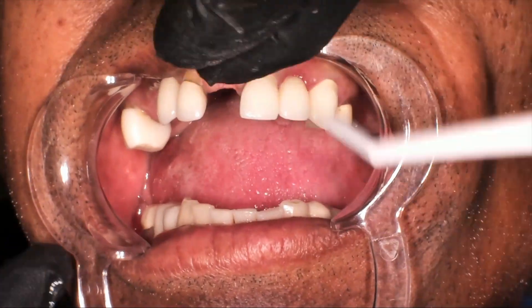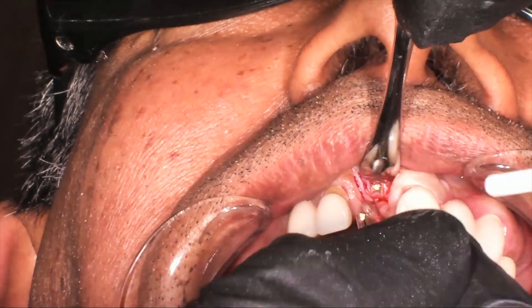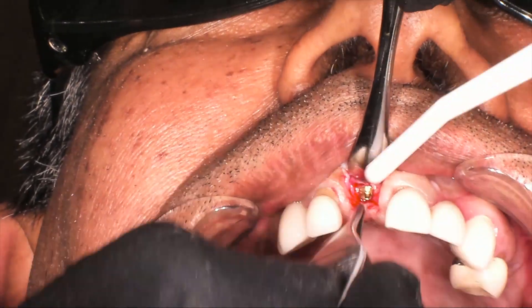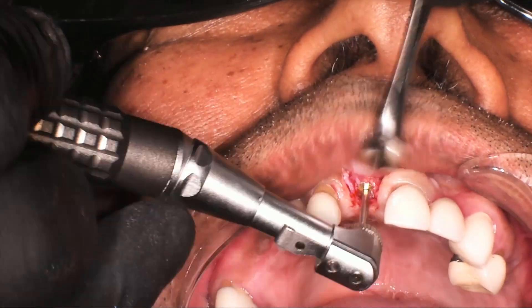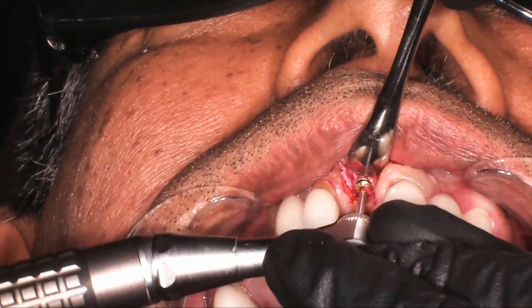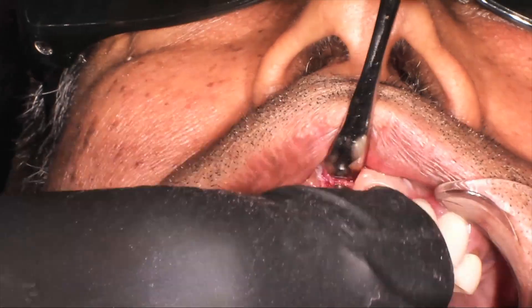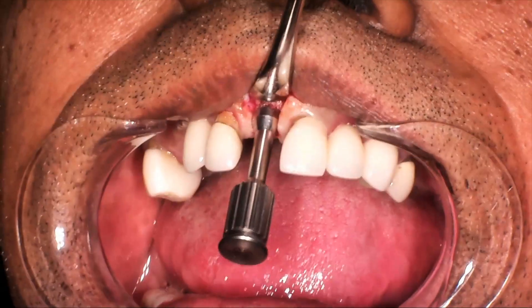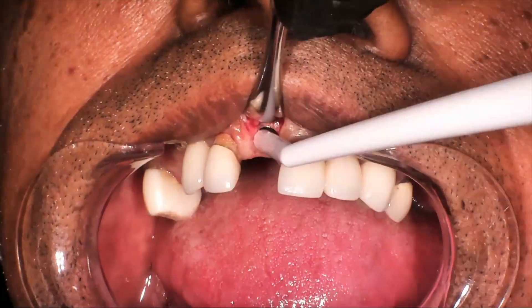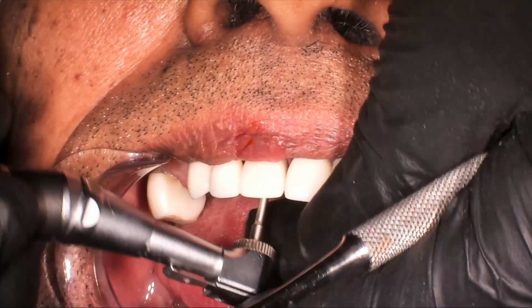We don't make a papilla-sparing incision — we kind of make a trap door so that we can get access to the implant. Now we go ahead and remove the cover screw. And then what you'll see afterwards is I use a bone profiler to make sure tissue and bone are out of the way, because in the anterior we're placing our implant slightly subcrestal.